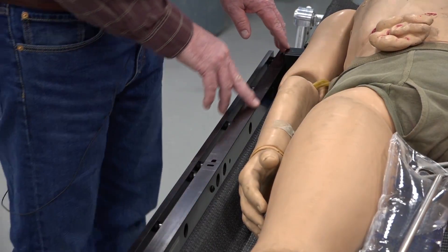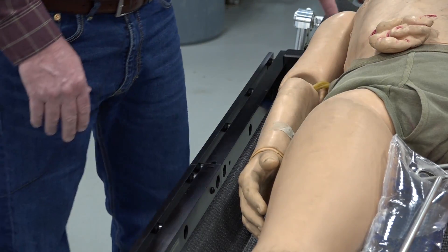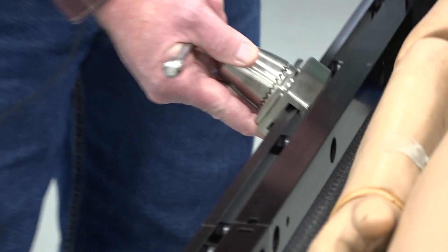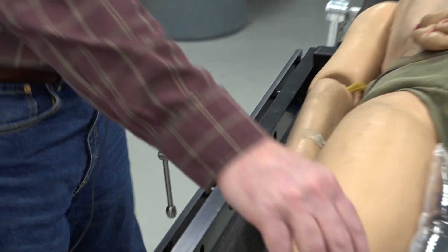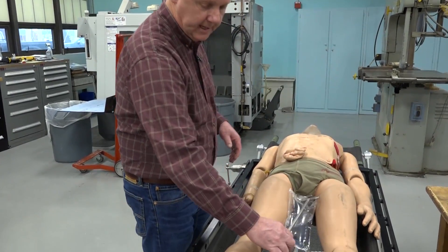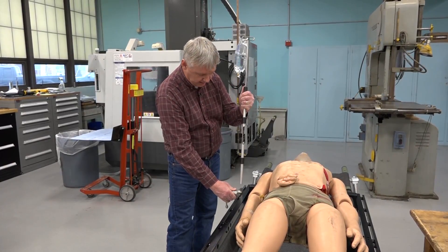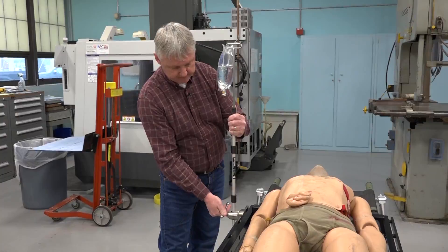The way it works is you can mount this rail system to a conventional litter. You can then take off-the-shelf attachments that attach onto the rail system, and then conventional type accessories that you'd find on any OR table will mount to it relatively easily.